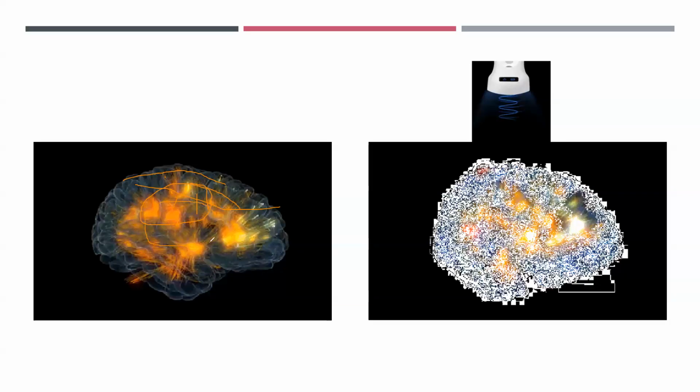And then you have fluid in the ventricular system. And really, that is the system over here through which sound waves basically travel at a constant speed without reflection. Now, if they don't reflect back, fluid will appear dark. But if this fluid has blood in it, as you see with an IVH, lots of blood in it, we talked about scattering. And that scattering phenomenon obviously will increase reflection and cause a bright appearance. So again, just another example of how the properties of sound within the brain are basically producing a map over here. And you can see as they interact, and I'm just going to show you this slide again.